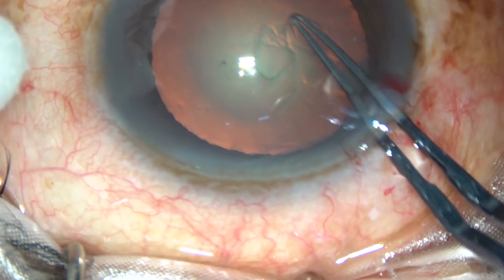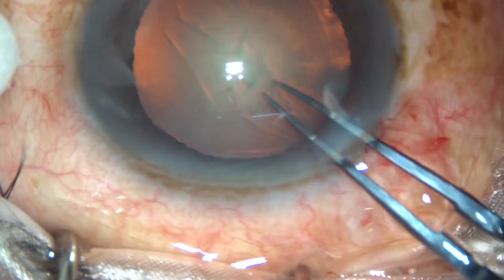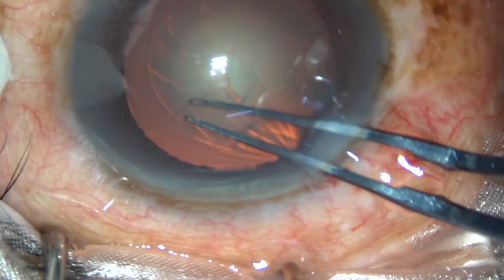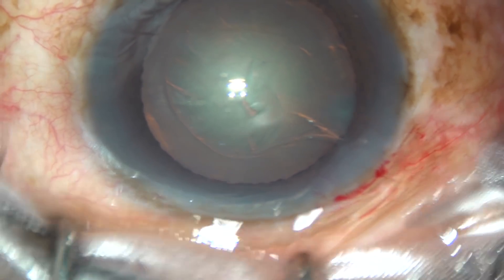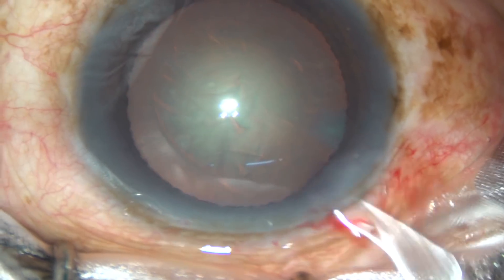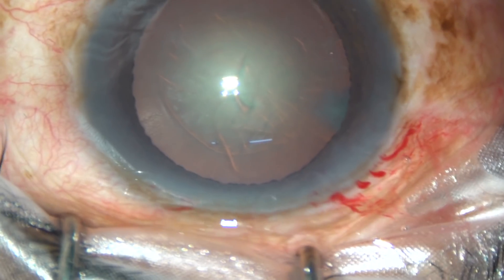By this time, incisions have been made. Only one side port has been done and now capsulorhexis is being done with the help of utrata forceps. This is a nice round rhexis. Now, hydro-dissection will not be done. Just some more viscoelastic substance is injected, and the tip of the phaco handpiece is introduced into the anterior chamber.